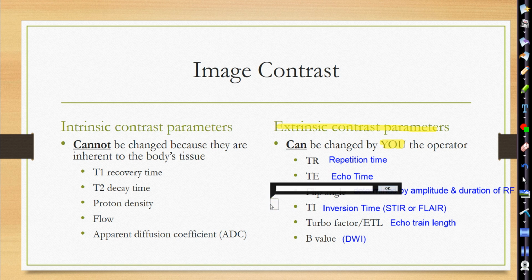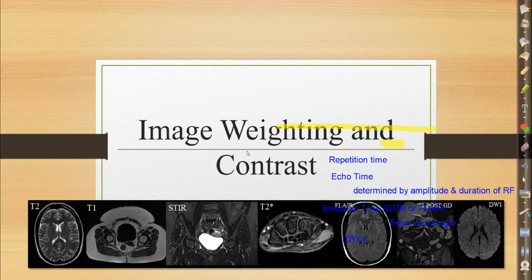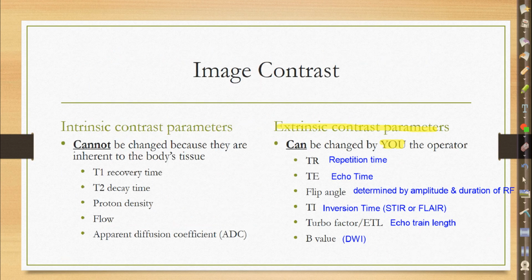So you can see here, just talking about some of these parameters, going back to our images, we have a STIR. Fat is suppressed. FLAIR, water in the lateral ventricles, or CSF fluid, is suppressed. Diffusion-weighted imaging is a very fast echoplanar imaging. If we see a little bright spot right there, we would be able to determine that's restricted diffusion, and that could be considered an acute stroke. We have T2 and T1. We'll talk about that, and I don't think we have a proton density on there, but just to give you an idea of how we get the different weighted images.